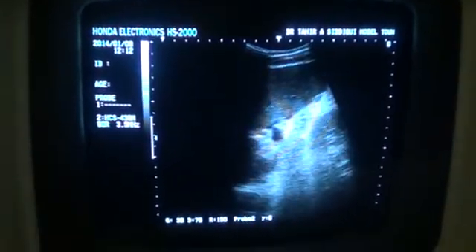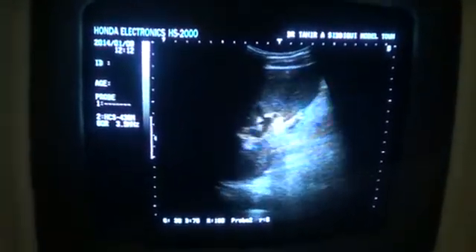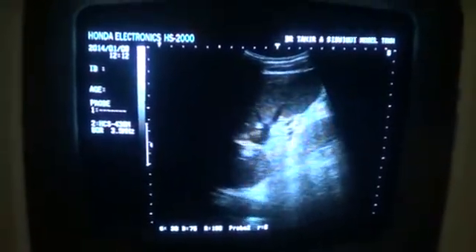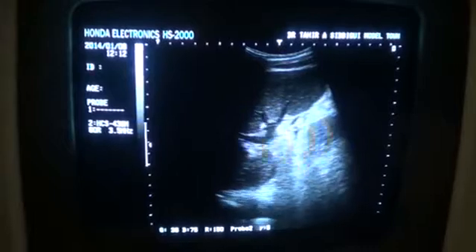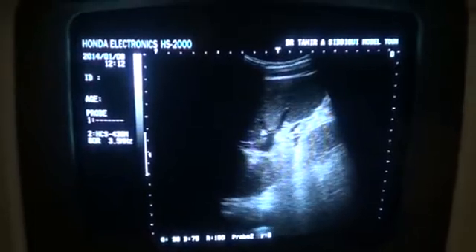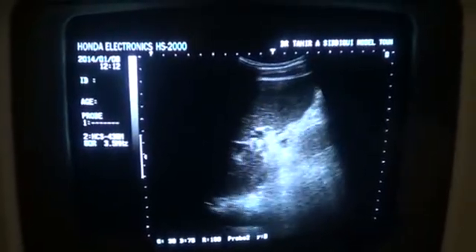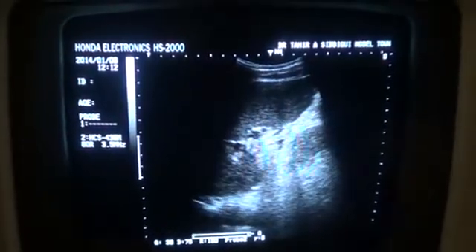I am scanning a patient. The patient is cirrhotic, has ascites and splenomegaly.